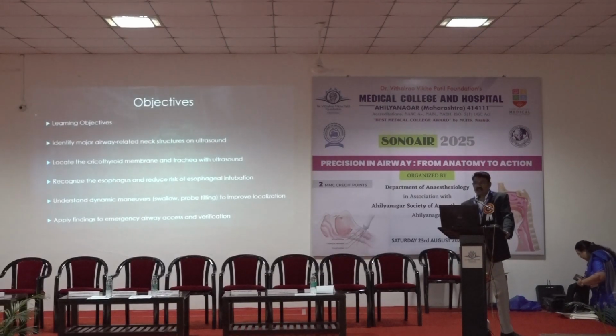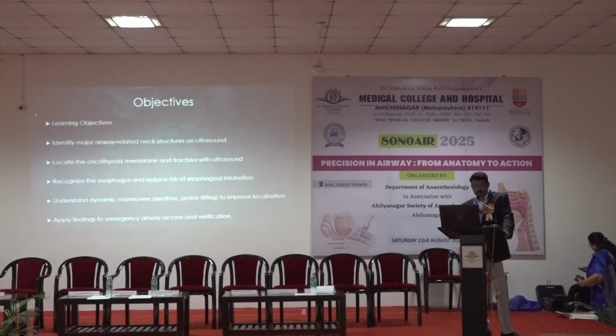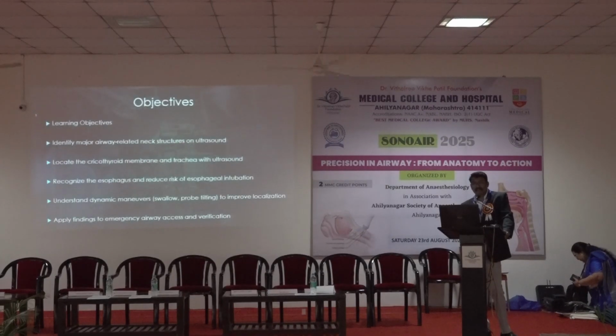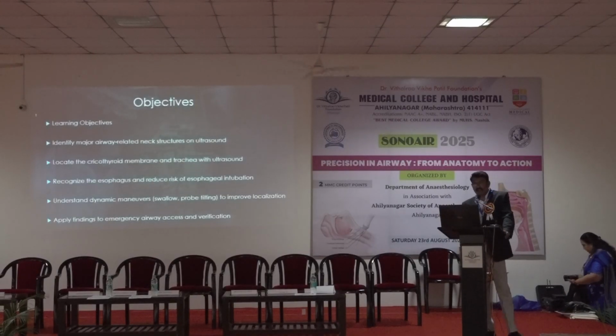Those will show us the size of the tongue or location of the esophagus. This knowledge will be applicable in the emergency as well as bedside screening for the difficult airway.